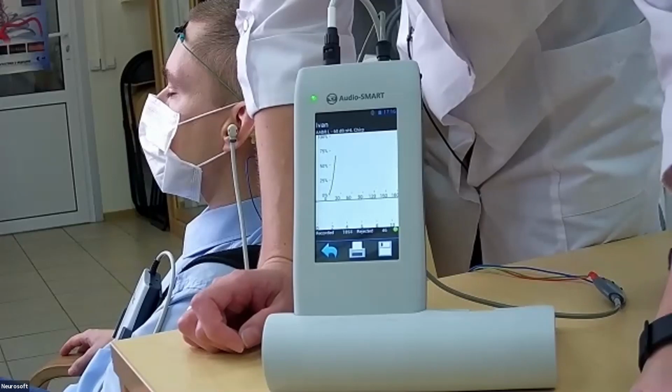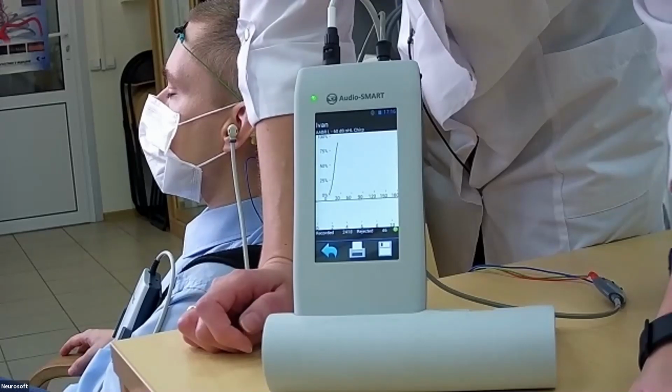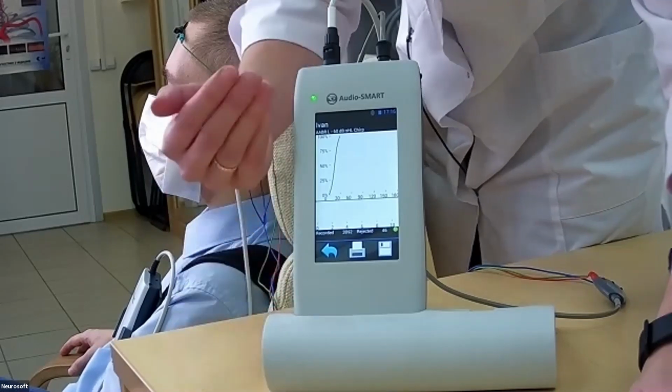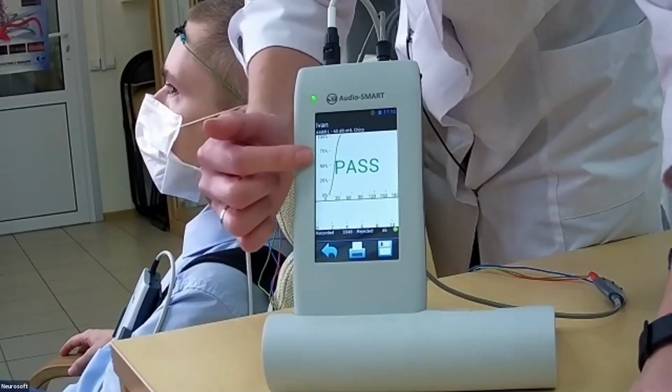The same mechanism is here. So we see the probability is high enough, it takes only a few seconds, and then it goes up for some time. We get the result pass.